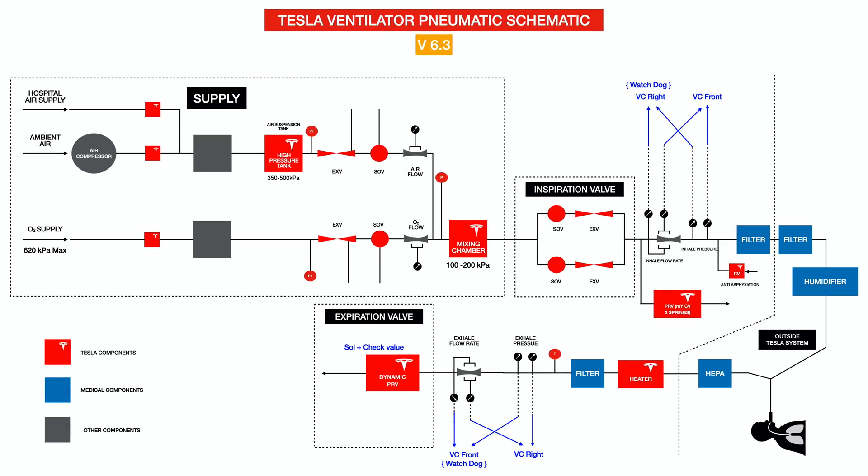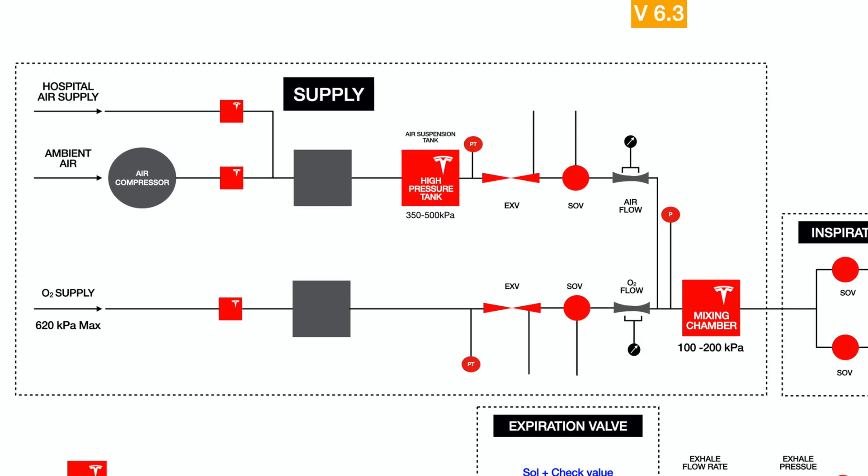The next thing you'll notice is Tesla has not taken any shortcuts. In the supply section of the schematic, the input can be hospital air supply — also called medical air — maintained at a pressure of about 345 to 380 kilopascals. It can also take ambient air, which can be compressed and used to ventilate patients. Of course, you can also use high pressure oxygen up to 620 kilopascals.